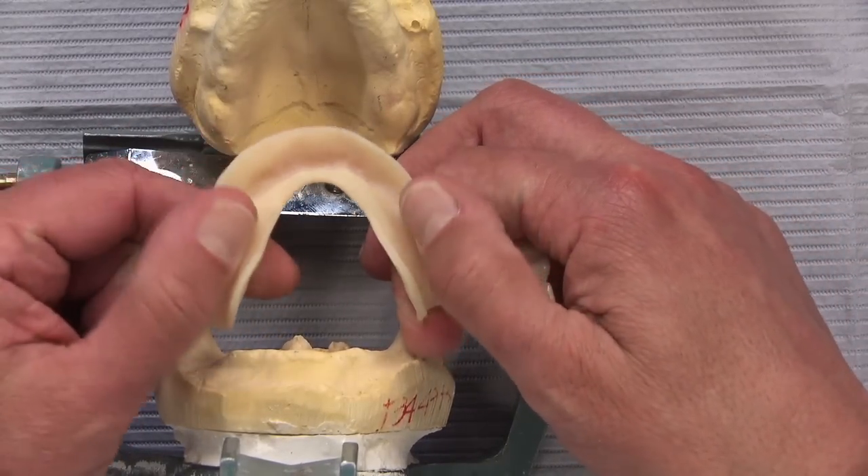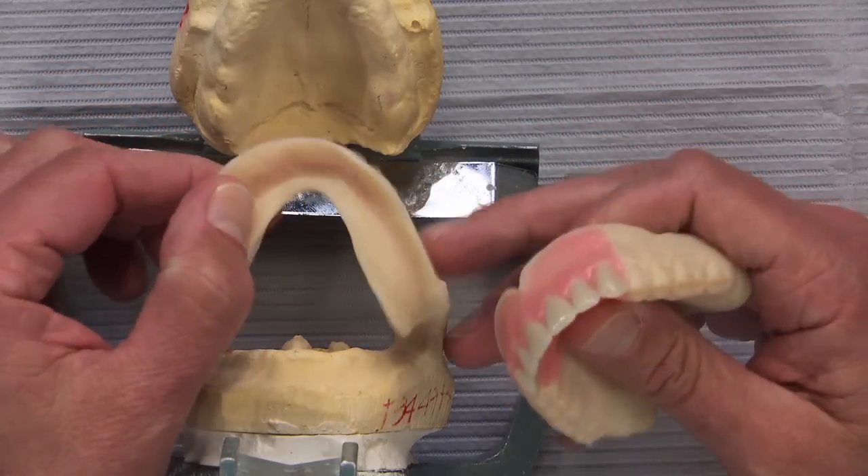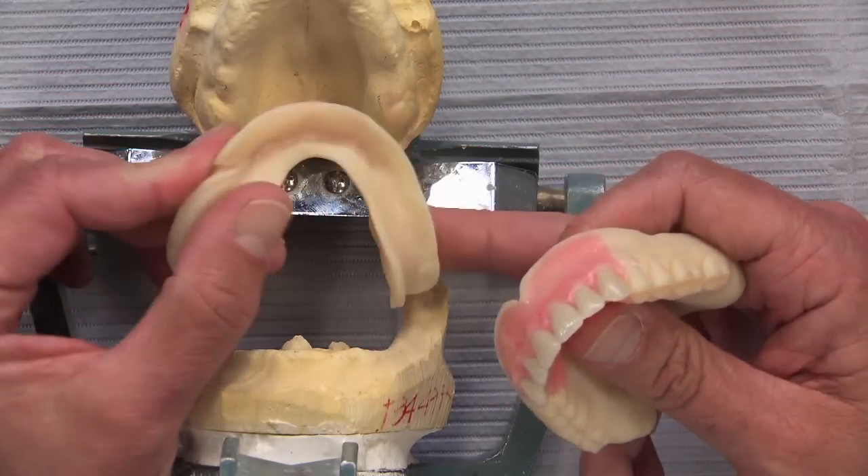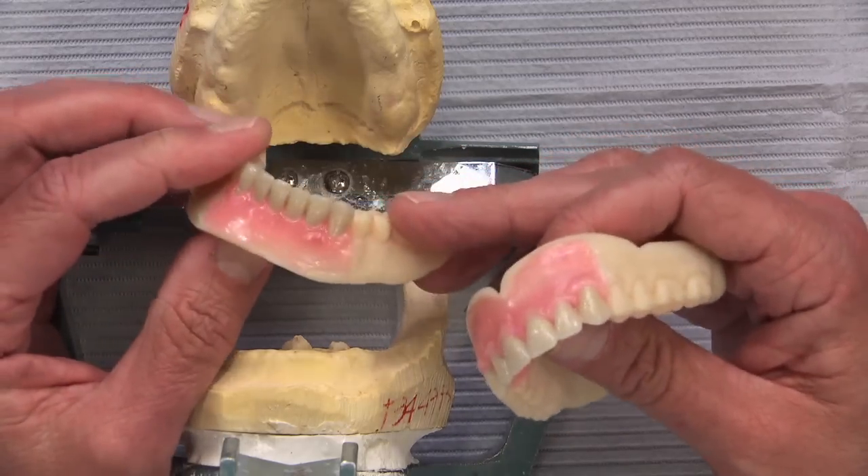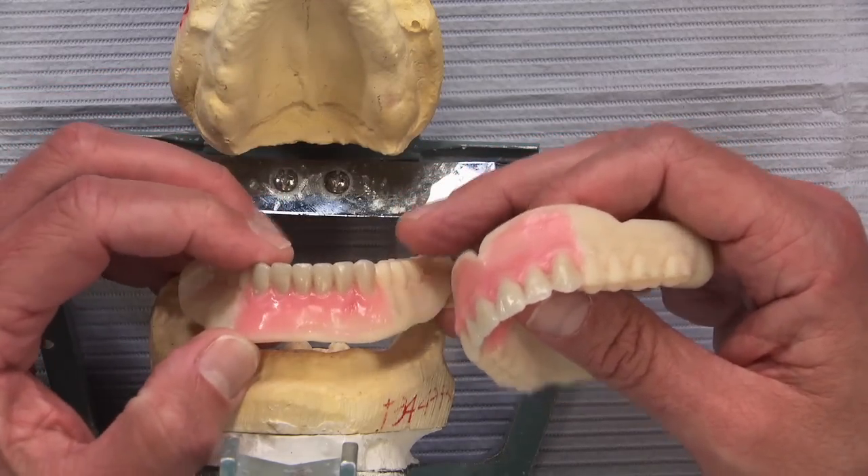The lower fits pretty well, but it's a lower so it won't fit like the upper does. Again, this is an accurate representation of what the final denture is going to be like, which will come to you at the next appointment. So there are really just two appointments after you take the impressions and send them to us.